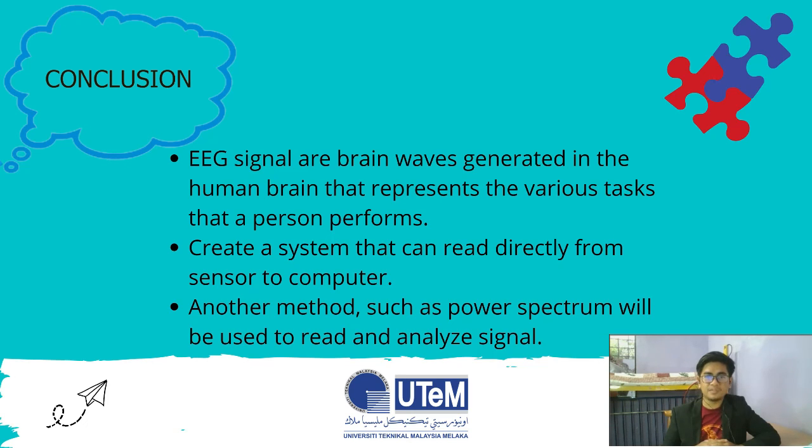Following that, other methods such as power spectrum and wavelet energy will be used to read and analyze EEG signals using data from the University of Bonn. Then the results can be compared to determine which is the best result.